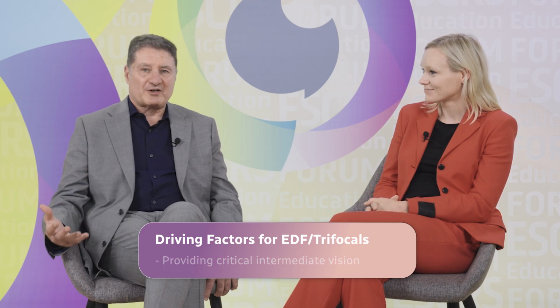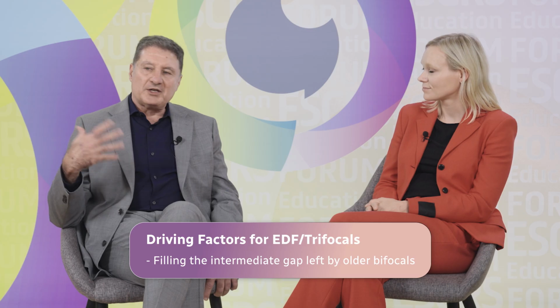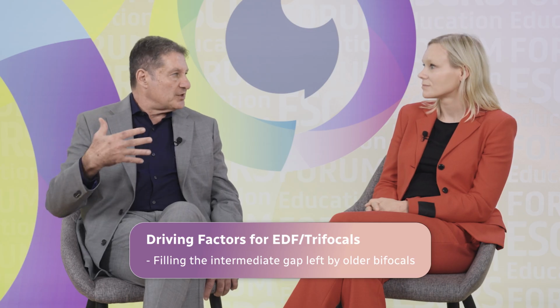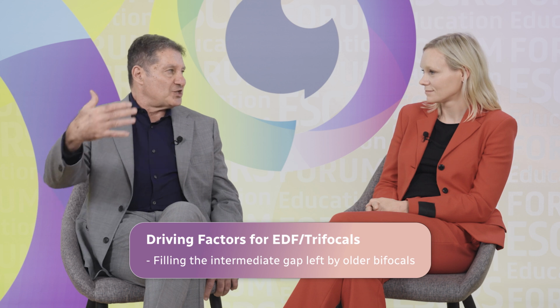Right, and the previous generation of multifocal IOLs, like the bifocals, were leaving these patients with a gap at intermediate. It has become more and more critical as digitalization is ongoing.